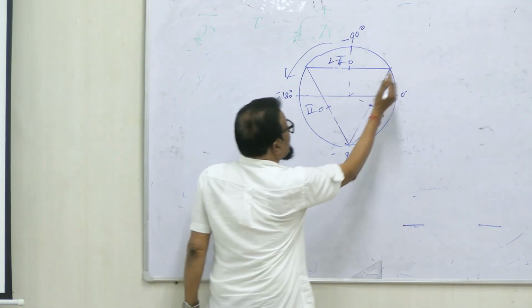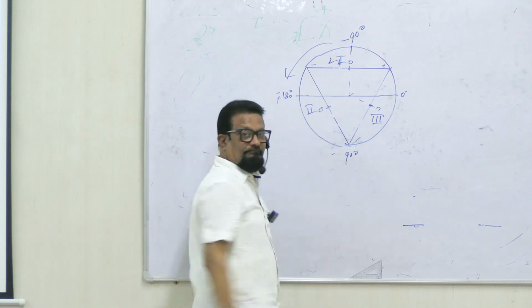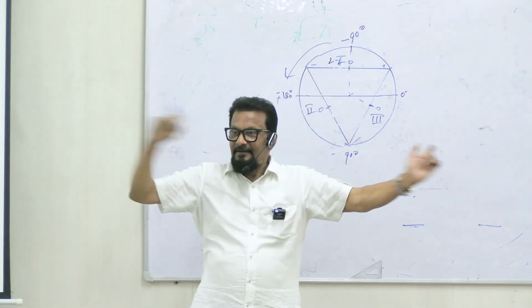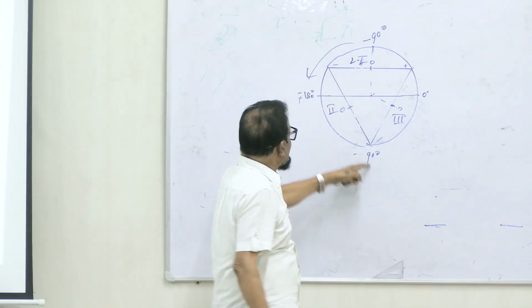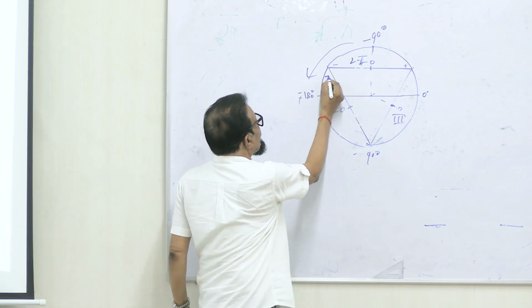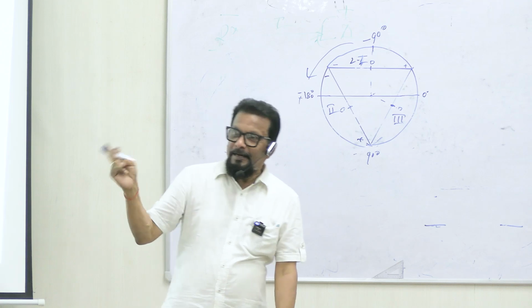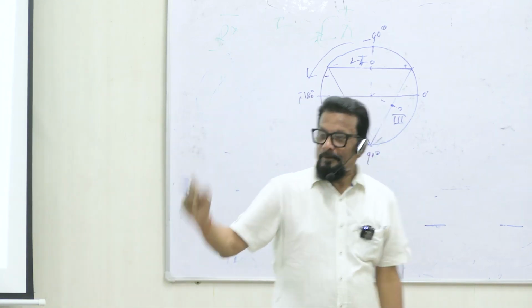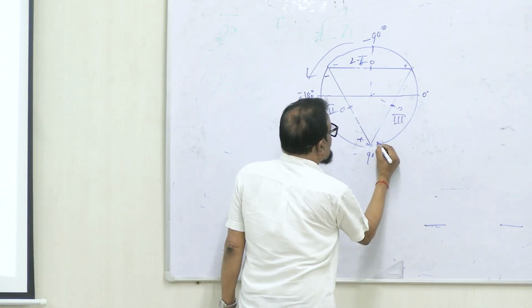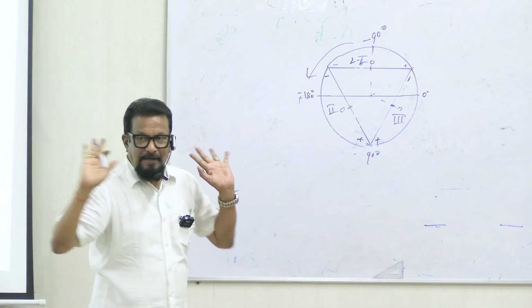And we know this side is positive and this side is negative. Positive, negative. And while this, what is this? This is negative and this is positive. Important. Otherwise we will calculate QRS in a wrong way. And for lead 3, it is positive, this side is negative. Okay? So now you are ready.